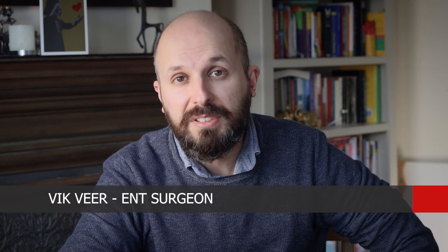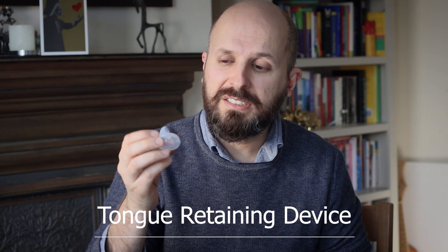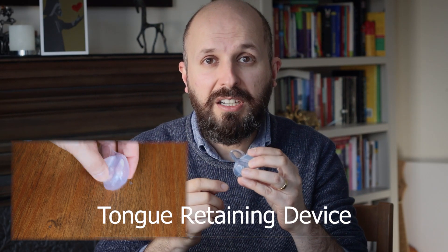Hi there, my name is Vic Veer. I'm an ENT consultant surgeon working for the National Health Service in England. Today I want to tell you about a device called a tongue retaining device, which in essence is a suction cap that pulls out your tongue and keeps it out of your mouth as you sleep at night. The idea is that you're pulling the tongue out of the way so you can breathe behind it.